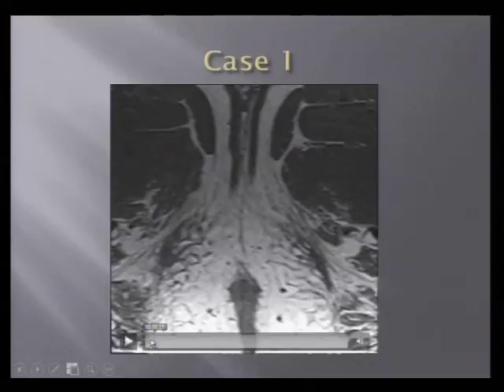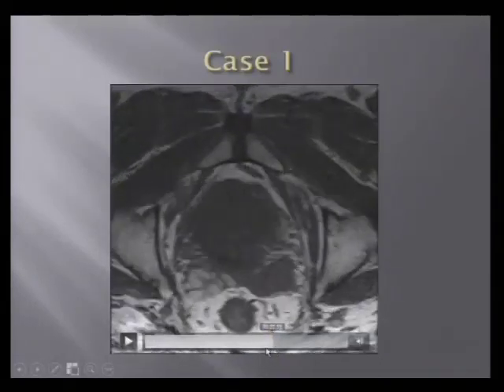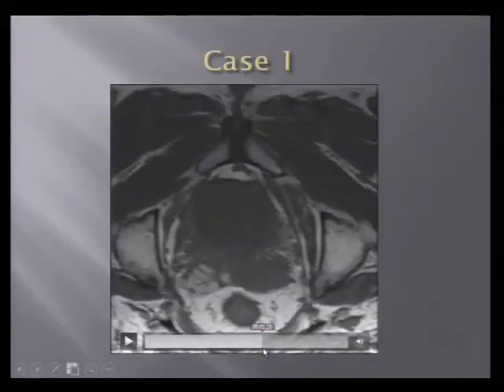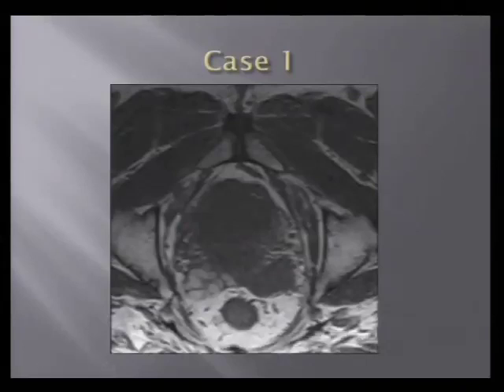And this here is a T1 weighted image. And it's going to come up eventually. And I only showed this because usually we don't have to use it, but it's important to have because you might look at this and say, wait, is that seminal vesicle invasion? What is that? Because you look at how asymmetric the seminal vesicles are. Hemorrhage is often, or usually, increased signal on T1. So in this case, the T1 just helped to prove that what's on the right is actually hemorrhage because it has increased T1. So the reason I'm showing that is just to show, again, this is an example of how you're getting more than anatomic information with these images.